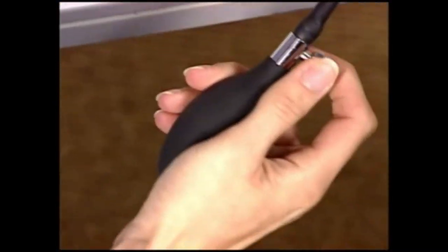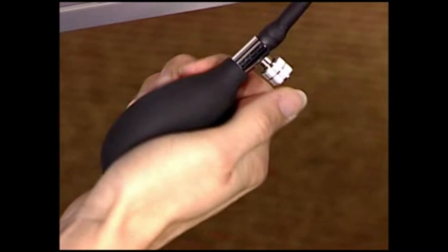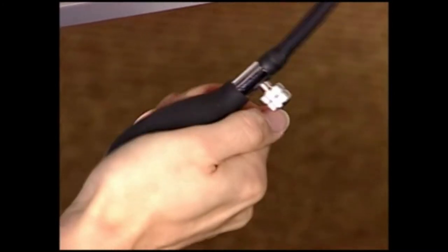Close the air control valve and, using the palpatory method, estimate the systolic pressure.